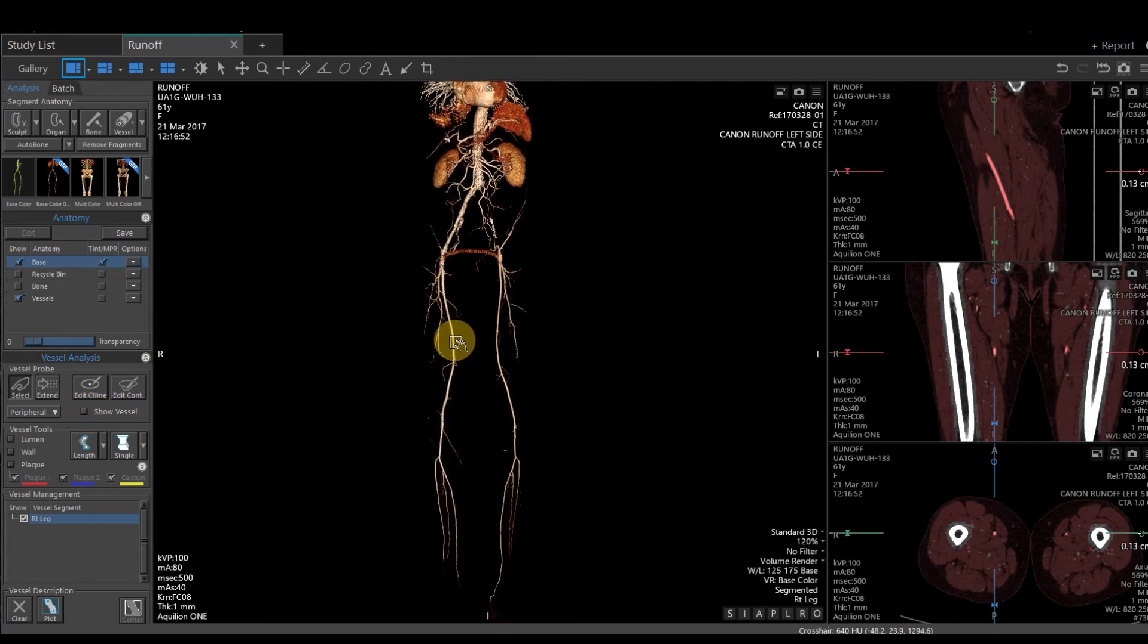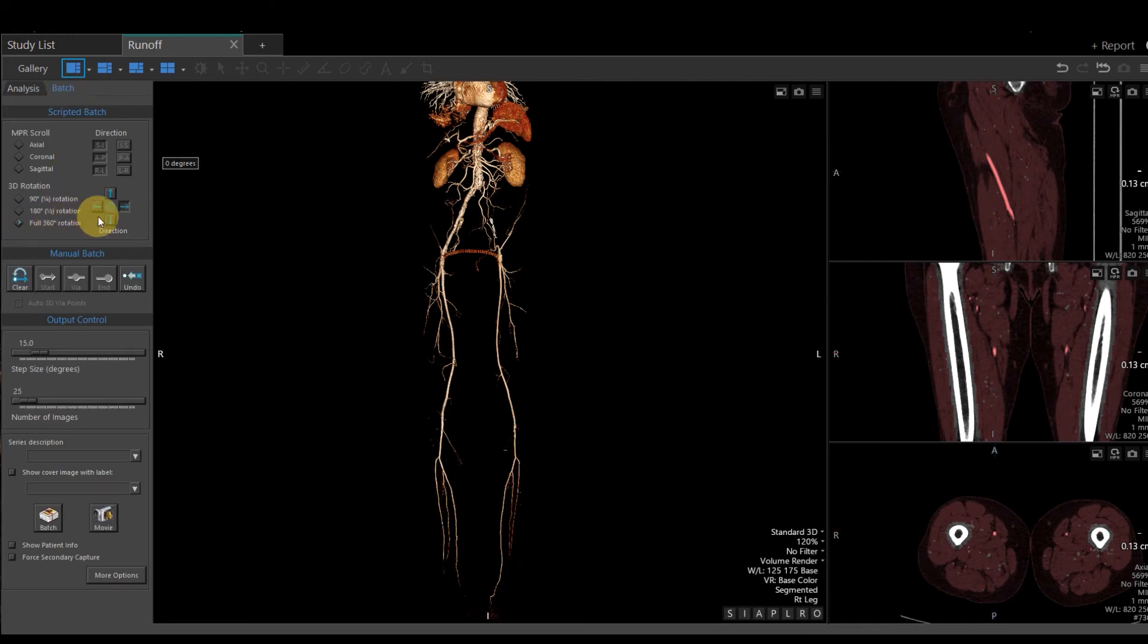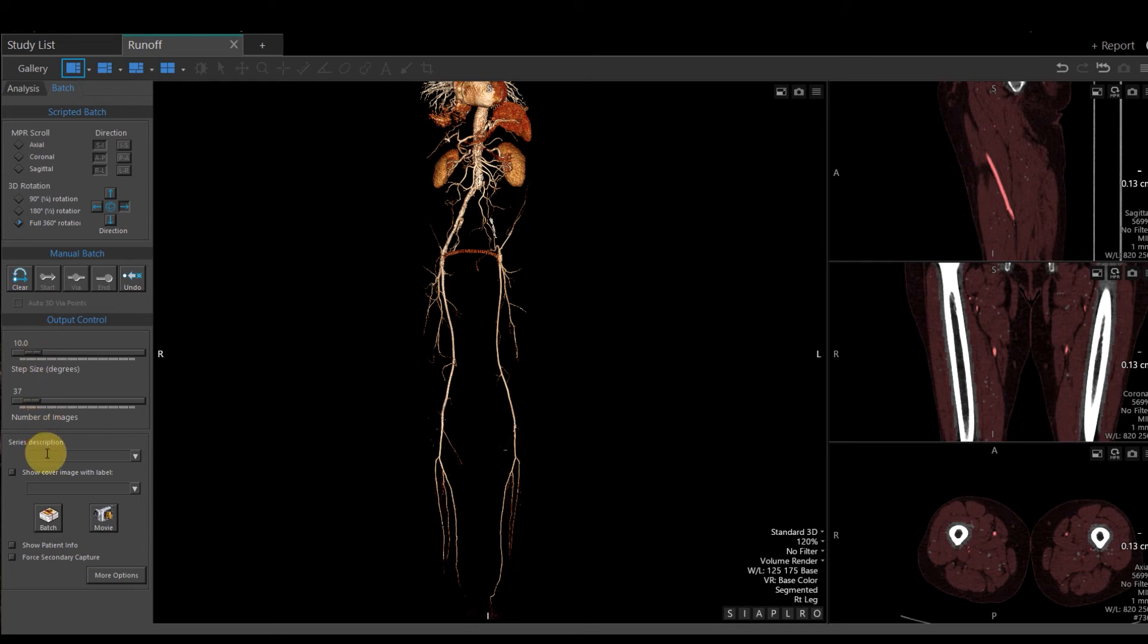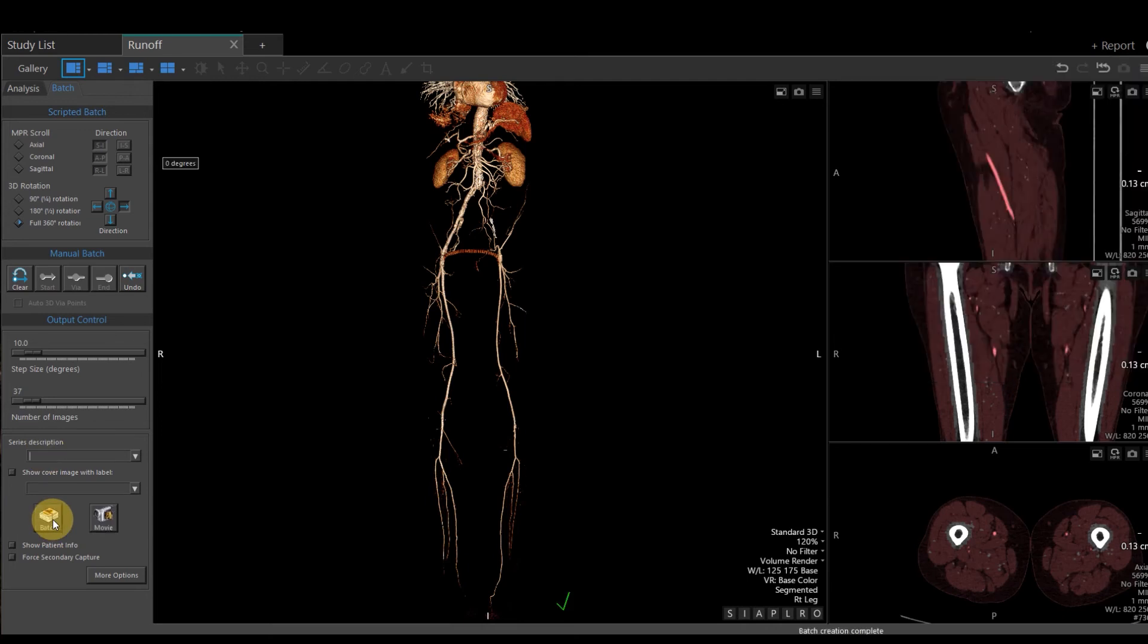The next thing I want to do is create a batch rotation. On the upper left-hand corner, you have a batch tab. I'm going to select full 360 degree rotation. I have a globe and an arrow directly to the right of that, and I can select which direction I want the image to rotate. Down below, I can change my step size or the number of images by dragging the little slide bar or clicking in the box itself and typing in a number. I can select a series description. Say I want to name it 3D Rotate. And then I want to select batch. That's going to rotate that 360 degrees.